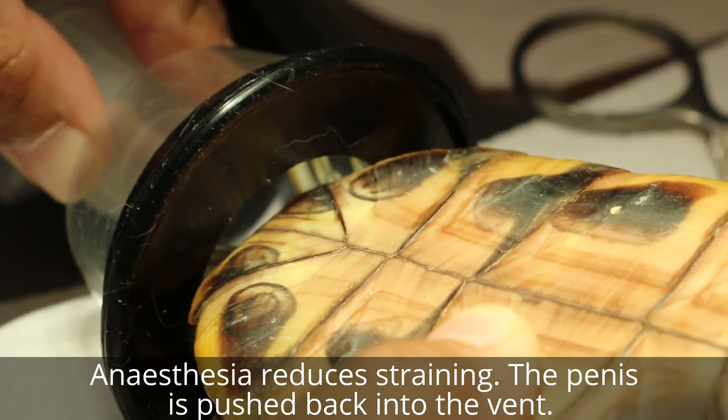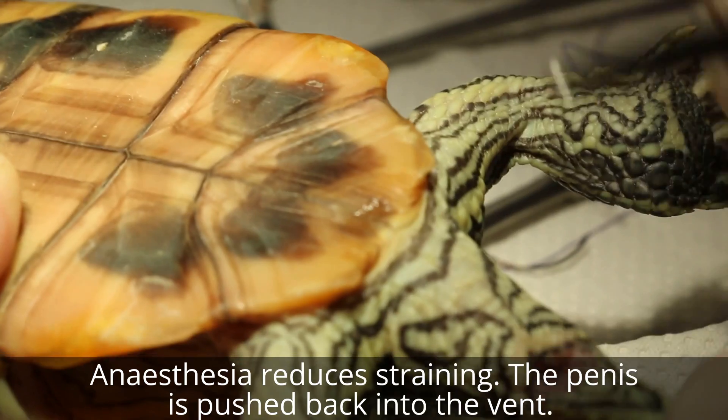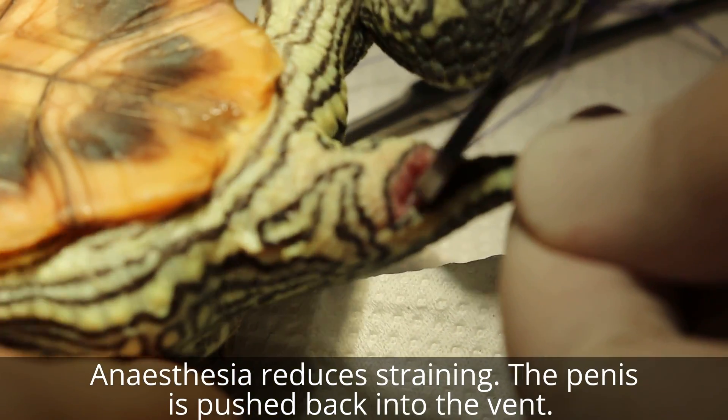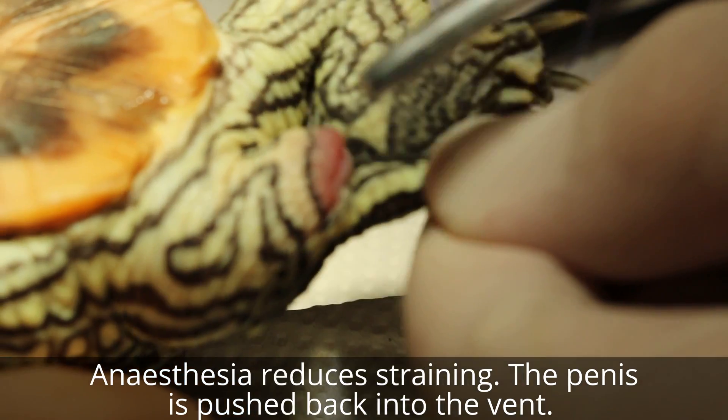Under anesthetic, you can see everything goes in - this is the vent. So I push it in as far as possible. This is the gas, it's at 5%. See that - 5% isoflurane.